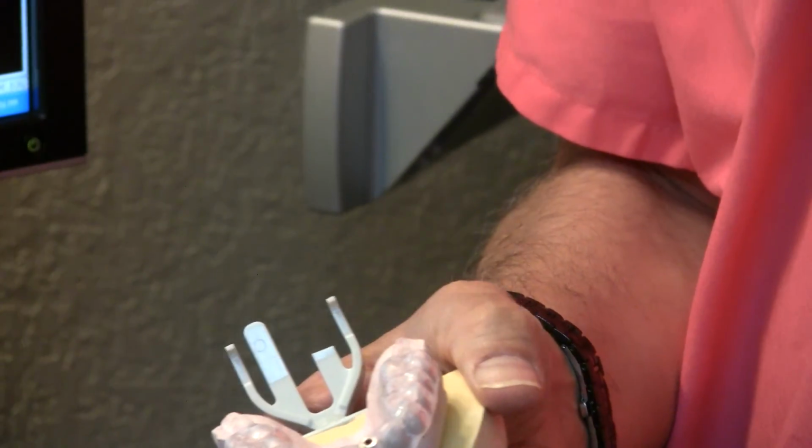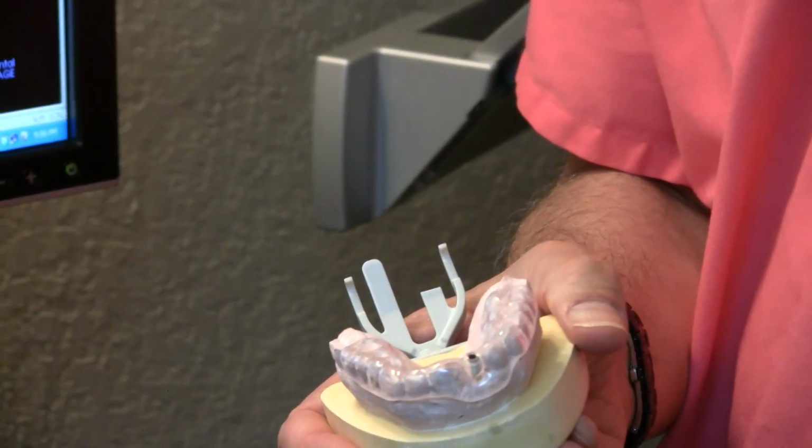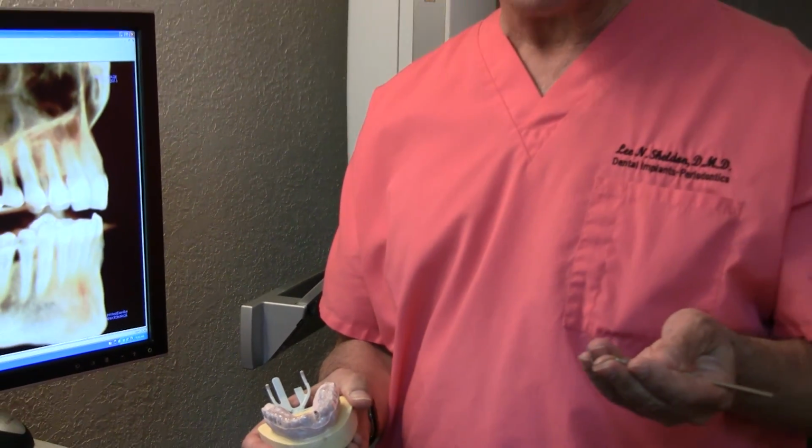Surgical guides are absolutely critical in many cases in order to be sure that the implant lines up both with the teeth and the bone. And it's up to us to work together to make sure we have the best result possible.